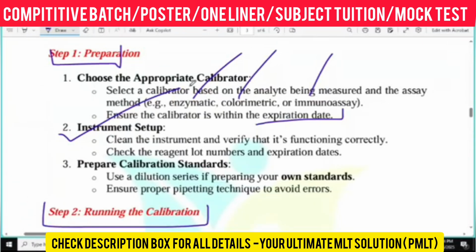Whenever you work in any laboratory, you will see a lot number of the instrument and a lot number of the reagent, right? You have to match the lot number with the date. If it's expired, you should not use it. So firstly choose the calibrator, after that choose and set up the instrument properly.